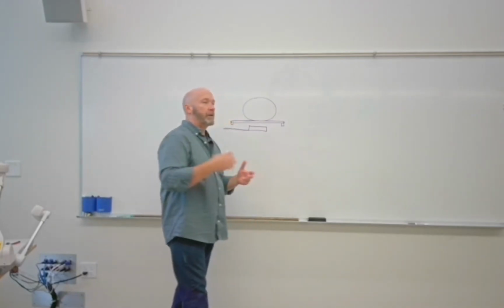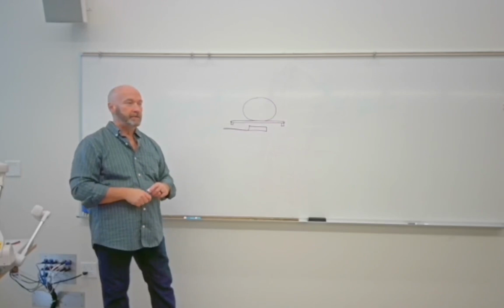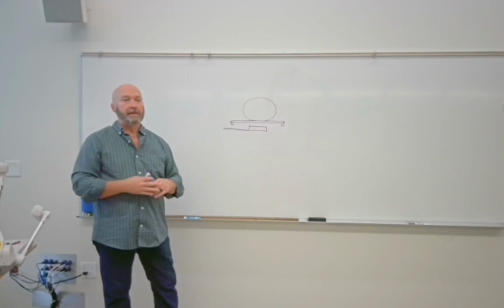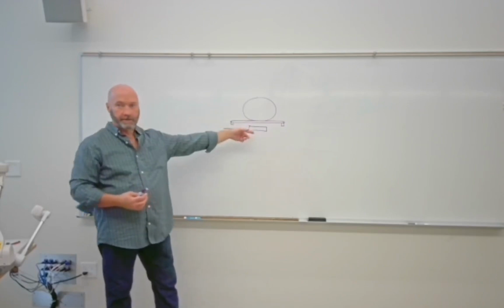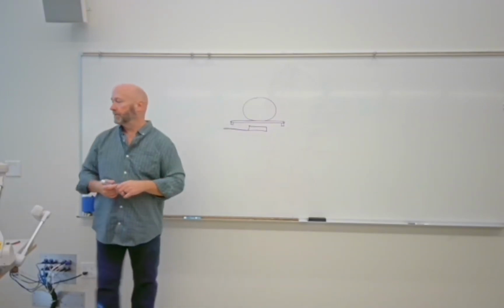So regardless of what you're shooting, even hands, extremity work, thinnest anatomy possible, you're looking for bones in the extremity work, right? So you naturally have an increased OID regardless of what you're doing. This just makes it worse. So magnification, increased OID always gives you magnification.